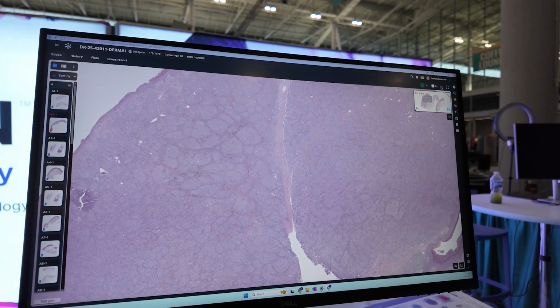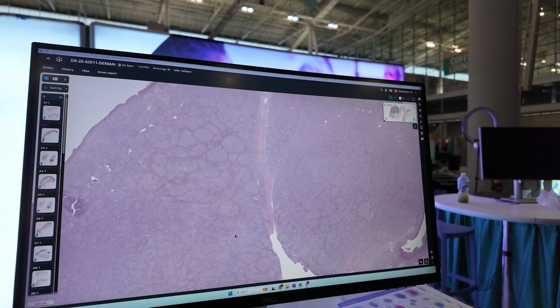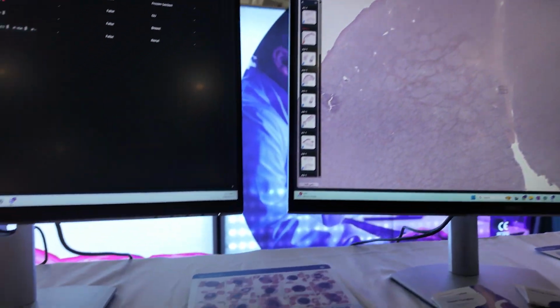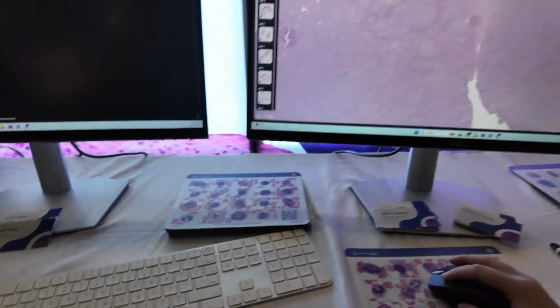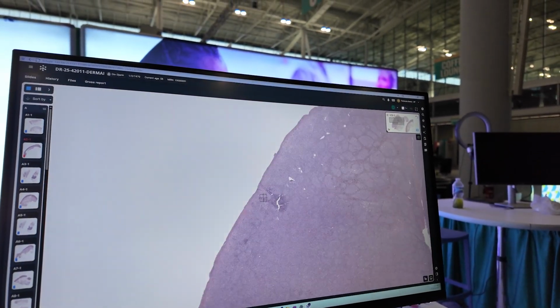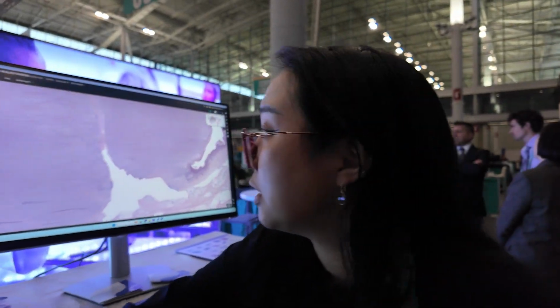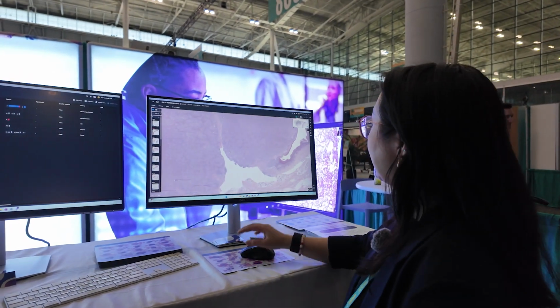But yeah, everything you see here in terms of annotations, rotations, panning, you can do all of those with keyboard shortcuts. So I can just hit the L button and this will take me to panning. So I can pan, and this is great because we know how tedious it is to do that drag and drop, drag and click. So this way we can just do it with our keyboard shortcuts.